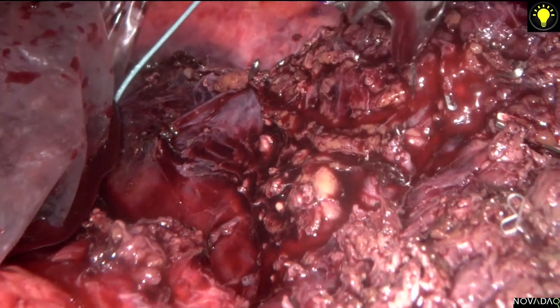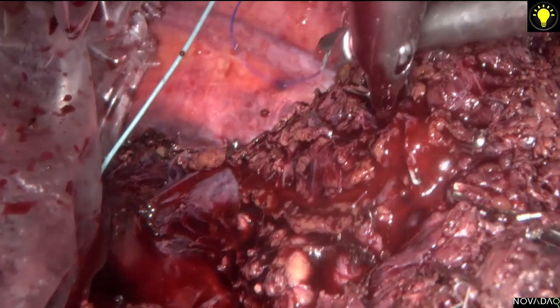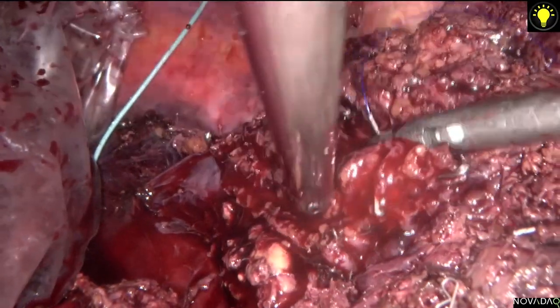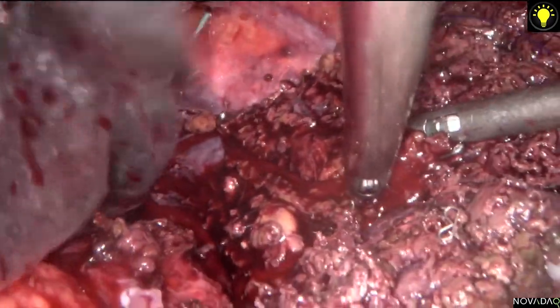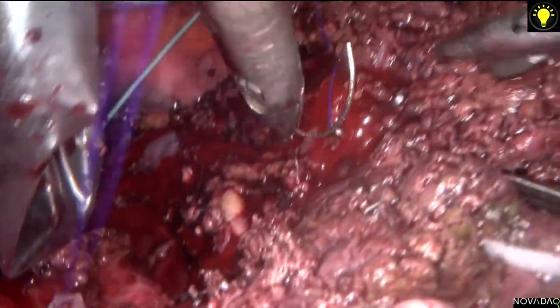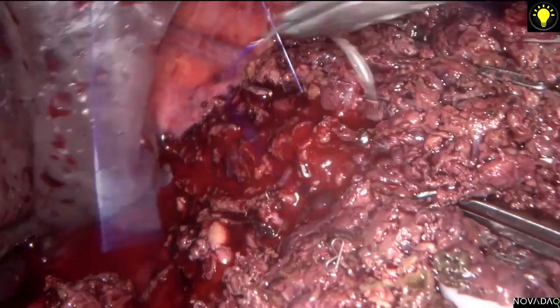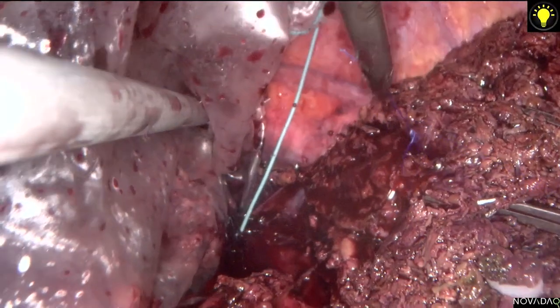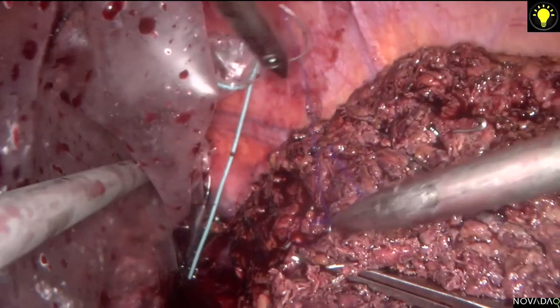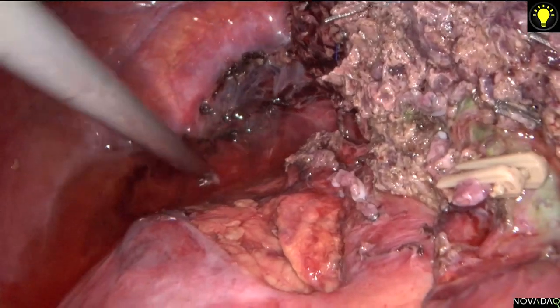This is a very important set of skills that a surgeon should have mastered before attempting to do major hepatectomy. This can be performed exactly as what we have done in open liver resections. When there is a site of bleeding, we control it with ligatures. The advantage of pneumoperitoneum is that it will actually reduce the flow of the bleeding. Right hepatectomy has been completed. The specimen was retrieved through a Pfannenstiel incision.